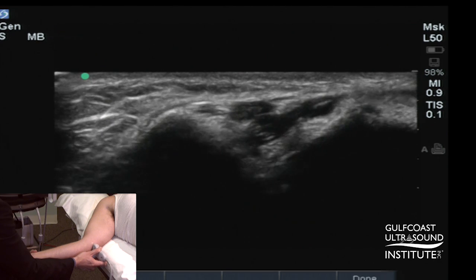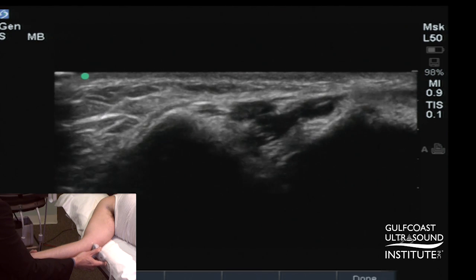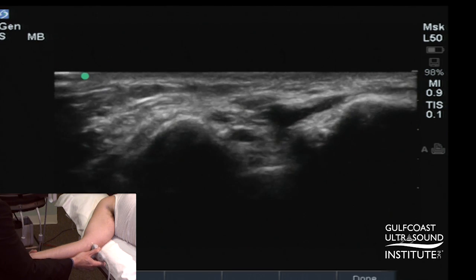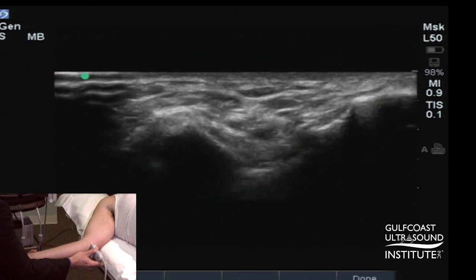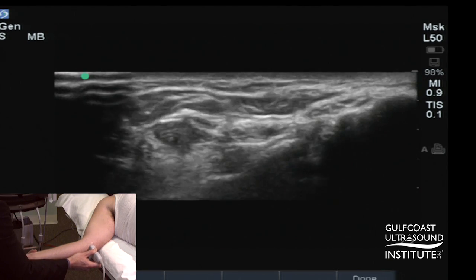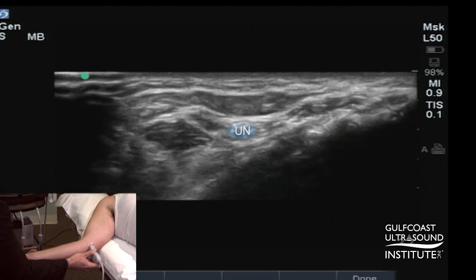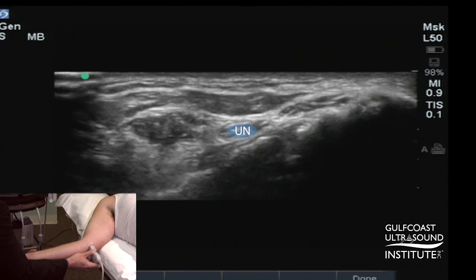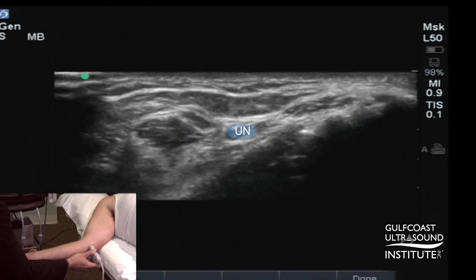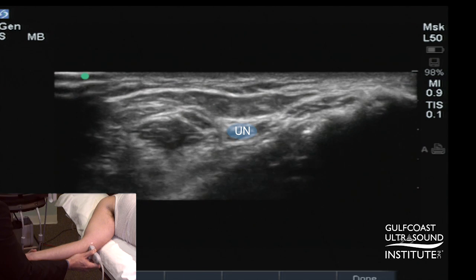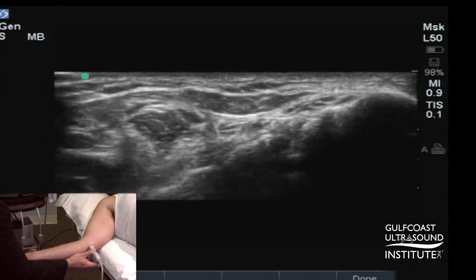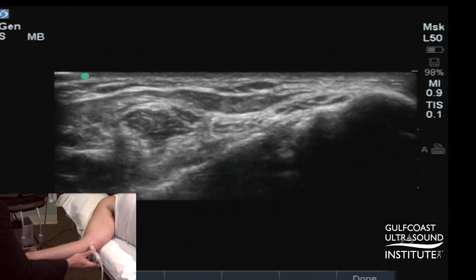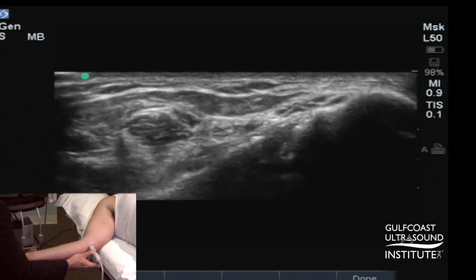If you move the transducer distally, you'll lose the bone landmarks, and then we'll see the ulnar nerve between the two heads of the flexor carpi ulnaris and under the arcuate ligament. Therefore, this is the true cubital tunnel.